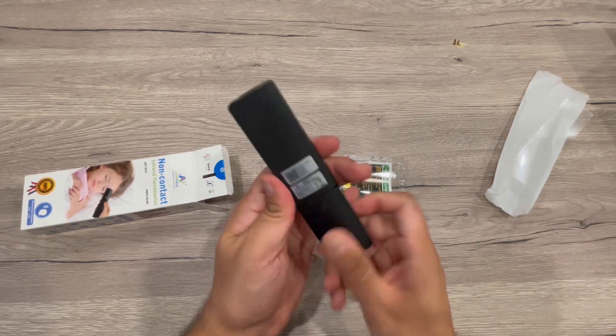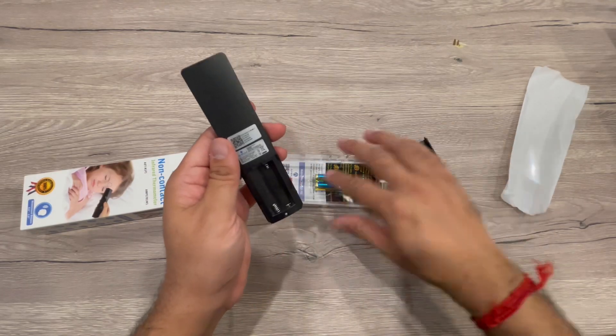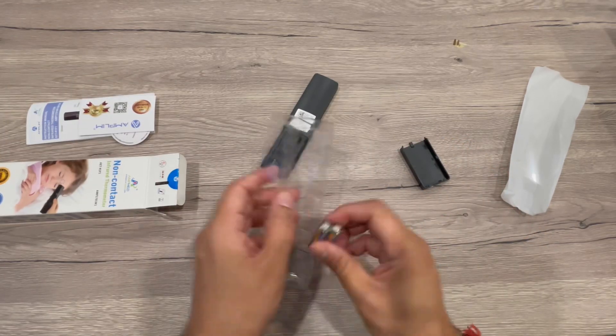I just removed all the covering and packaging — it looks really nice. It requires two batteries, and batteries are supplied with it, so let me put these batteries in.